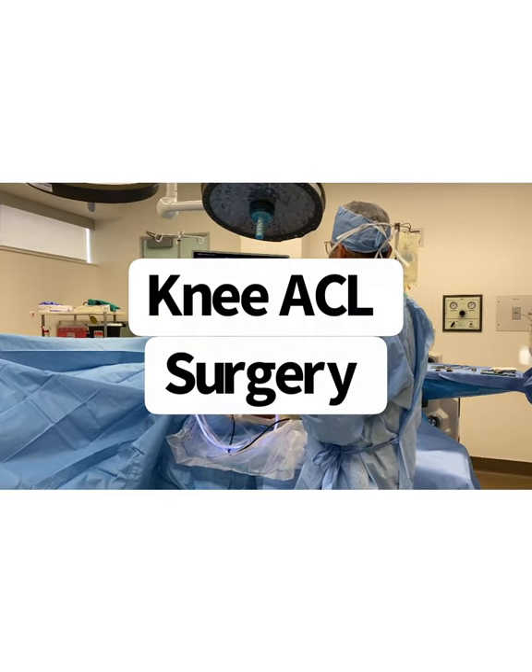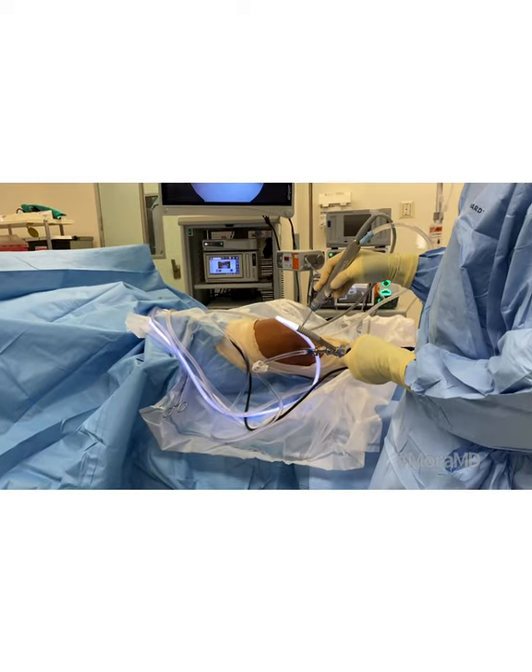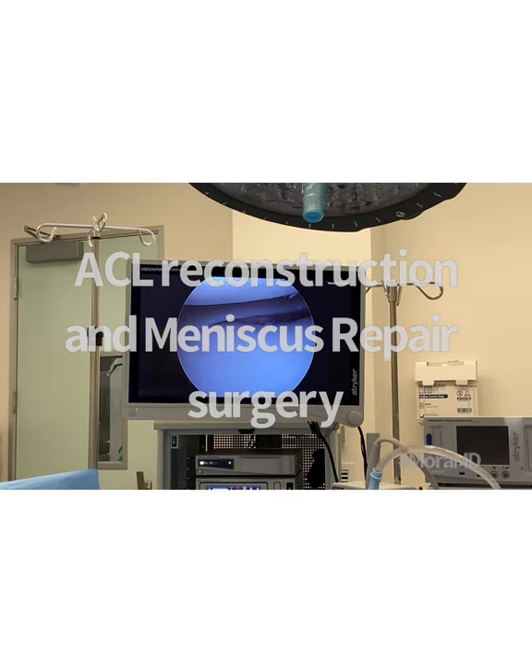This is a very interesting case — a very common situation involving Jiu-Jitsu athletes. We're doing a surgery to treat an ACL tear and a meniscus tear.